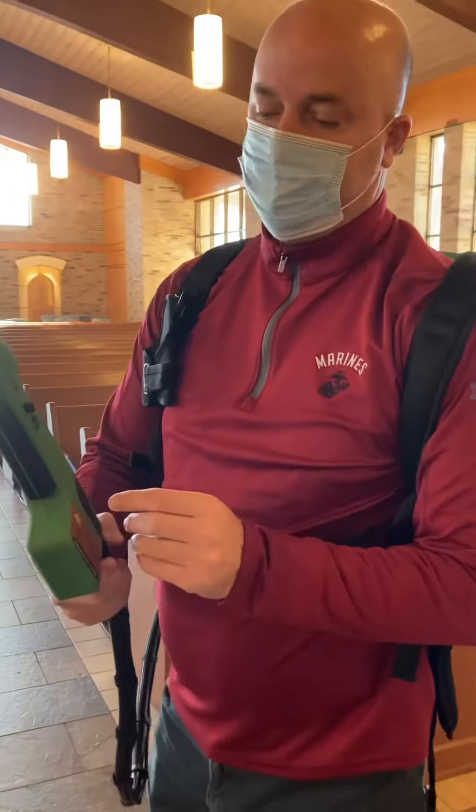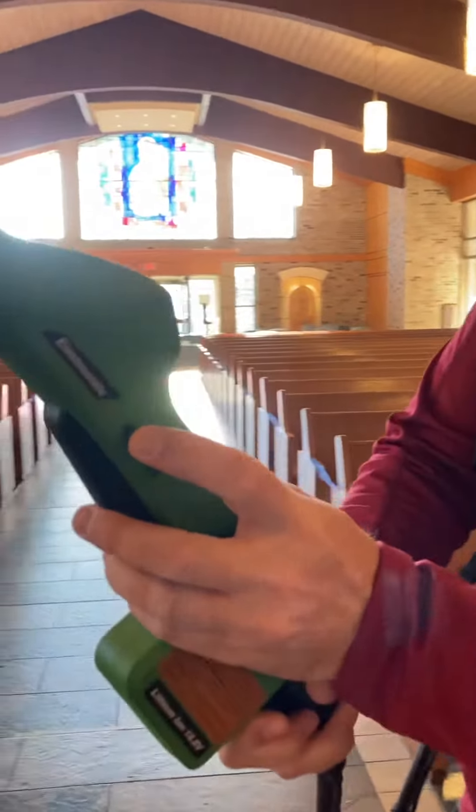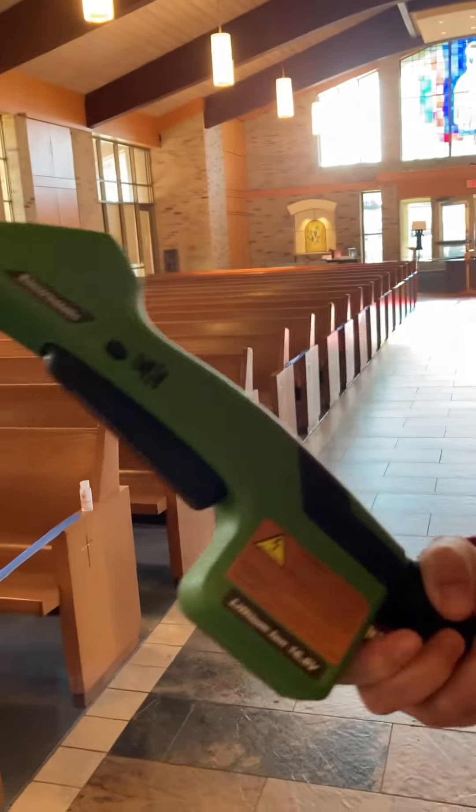It'll always be in the lock position at first, just so nothing drips out. And then all you do is push it across to unlock it. If you wanted to lock it again, you just push that back. So you unlock it and it's ready to go.